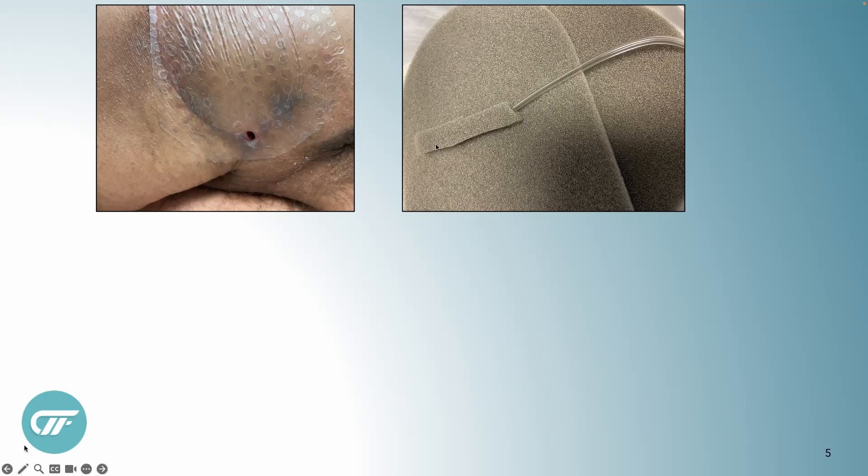What I do is I take a piece of the thicker foam that comes in the Veriflo Cleanse Choice kit, clip a hole all the way down, then cut the top off of the tubing for the instillation and shove it in. It's like a gopher tail — it has instillation so it gets all the way to the base. We have a lot of gophers in Minnesota and they're so cute, so we decided to call it that.